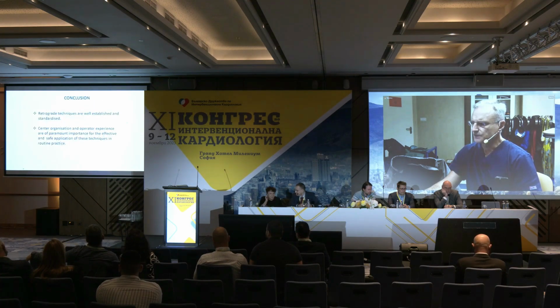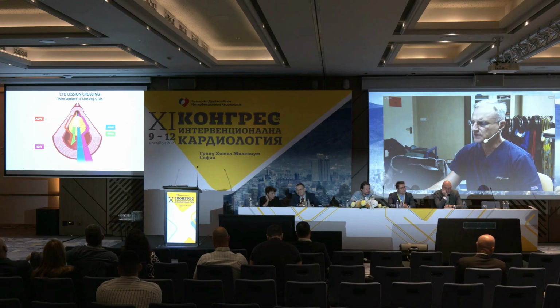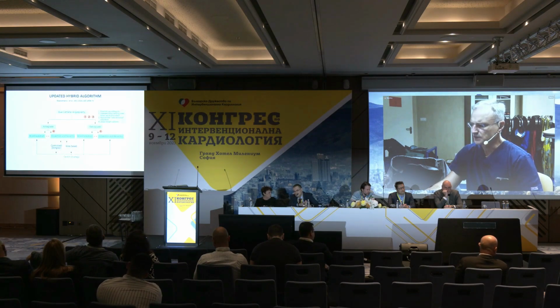In this case, what I want to summarize is that there was a lot of confusion over the years, and we standardized the antegrade dissection and retrograde dissection reentry techniques, and wire escalation antegrade and retrograde. That was a big step in order to be able to speak the same language.